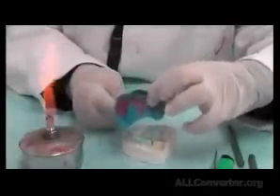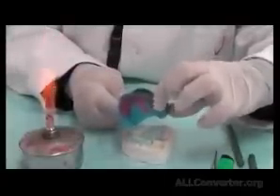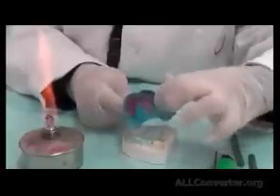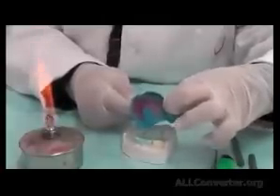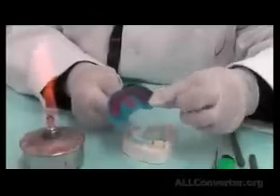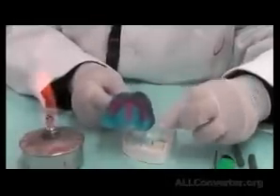Once more I cool my fingers and then shape it, gather it all together. Anything that went into the fitting surface, I take it out. Anything that went outside, I put it back. So I have a new border now. This new border is not corresponding with the patient's mouth. I have to have it as a copy from the patient's mouth.